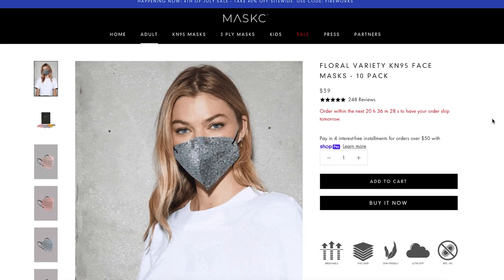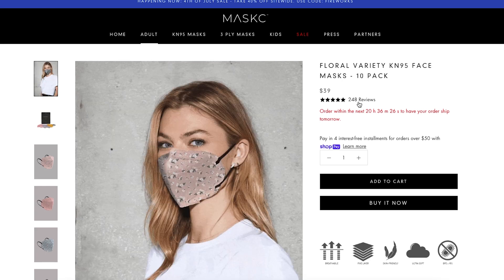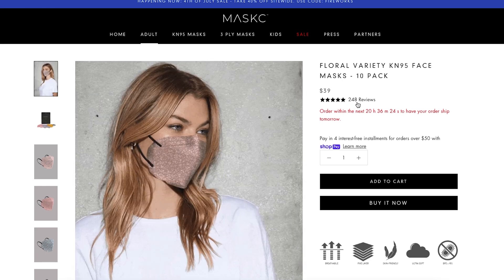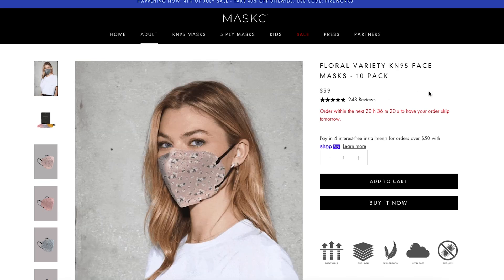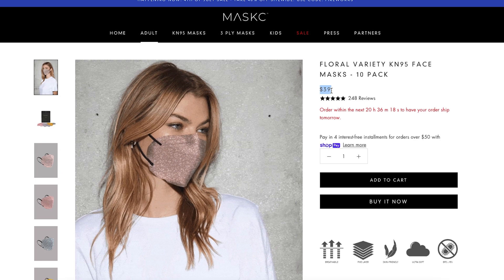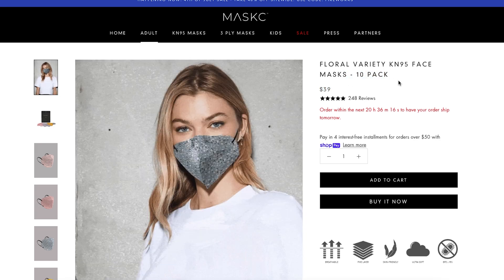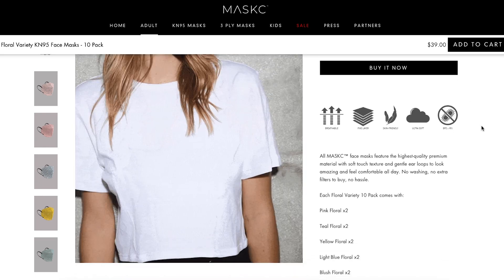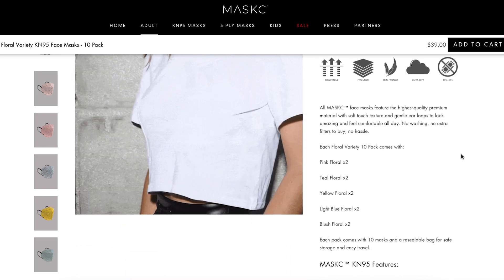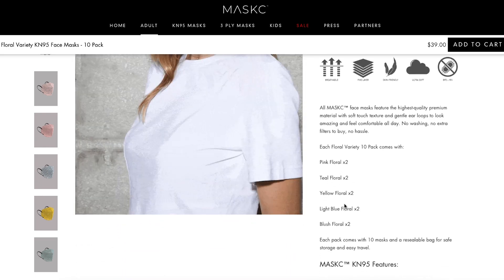We ordered the floral and the clay variety pack, but the clay ones are no longer available for sale. So we're going to be looking at the floral variety KN95 mask listing. They have a rating of 5 out of 5 with 248 reviews. These are a little bit on the pricier side — they cost $39 for a 10 pack, making them $3.90 each.